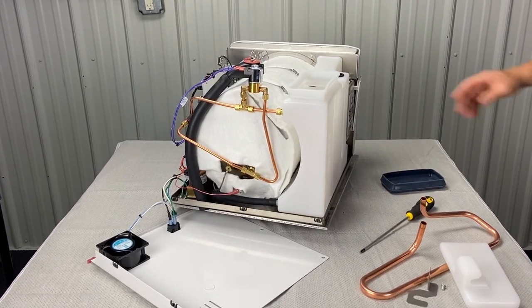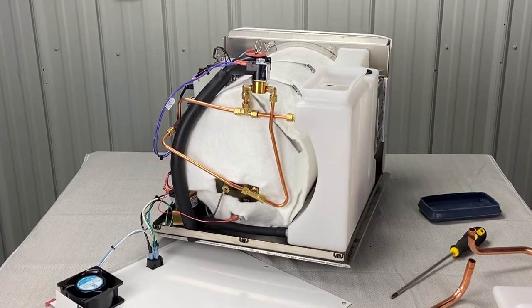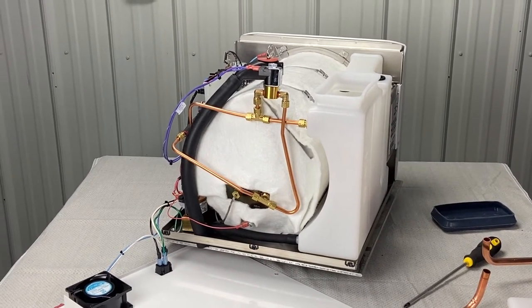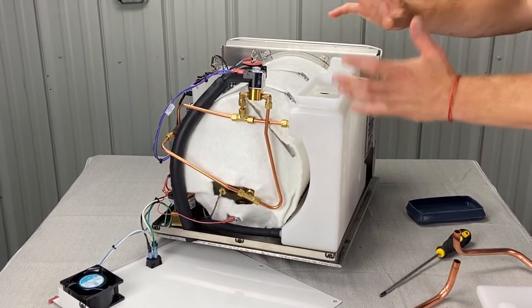We do a lot of troubleshooting videos here, Midmark specifically. Right now I'm going to show you how to put the cover back on of a Midmark new style, either M9 or M11. It's the same process — the M11 is just a little bit bigger. So we have this thing down to bare bones.